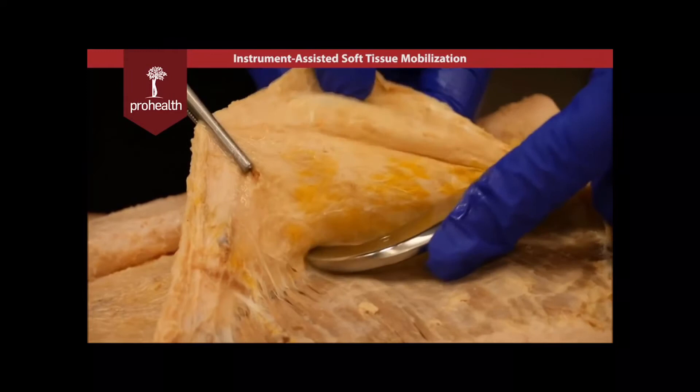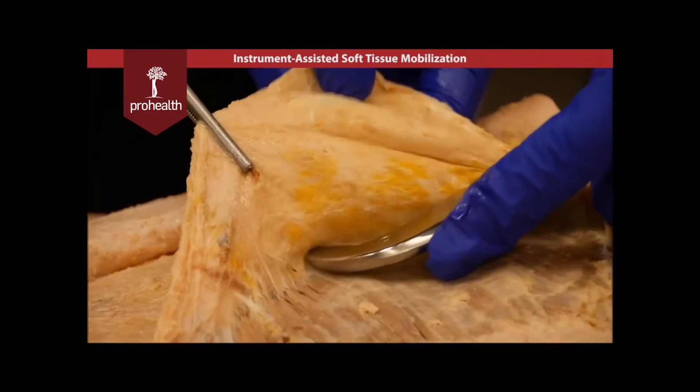If you look really closely at the junction between those two structures, you're able to visualize the superficial fascia and deep fascial connection right there. With various techniques and movements in different regions of the body, you're able to release different forms of scar tissue and adhesion that will improve overall function.